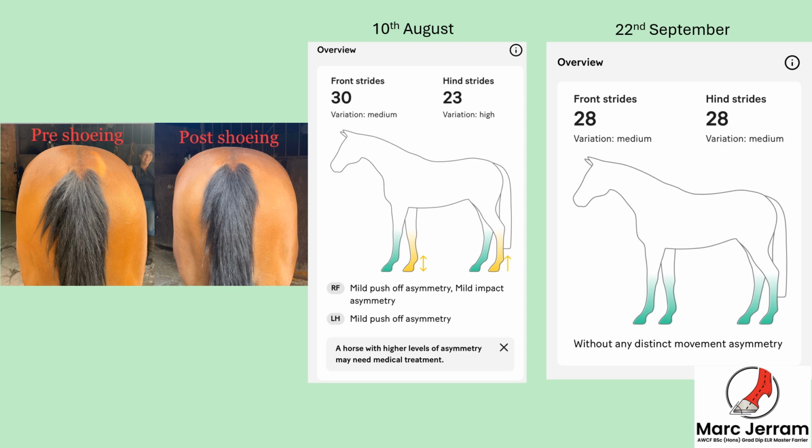So very good outcome for this horse, and very delighted that it's something as simple as this application that we can use for Farriery, because it gives us a justification for our corrective Farriery protocols to basically try and impose symmetry on an asymmetrical structure and to allow the horse to have much more fluid movement.